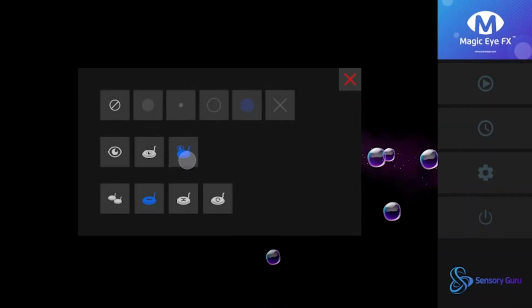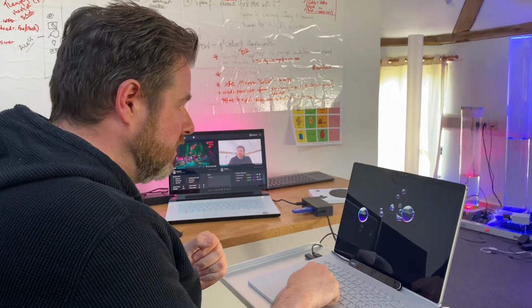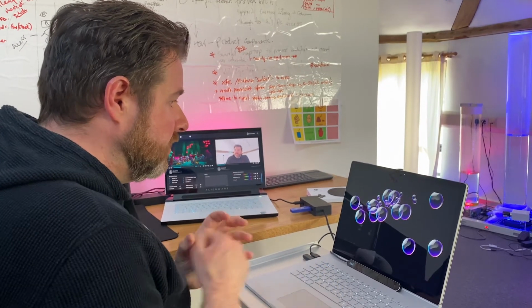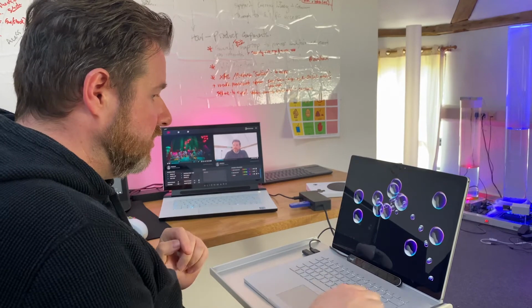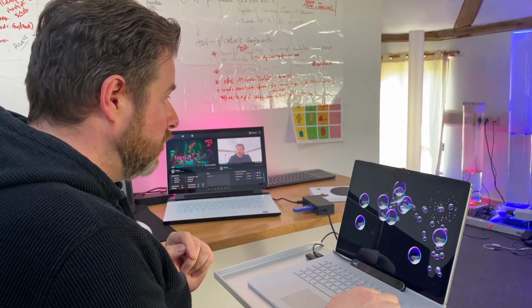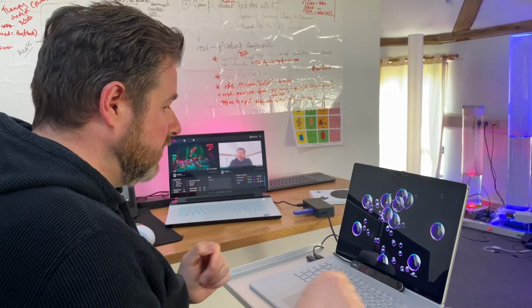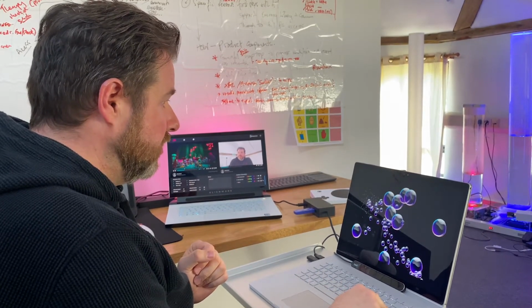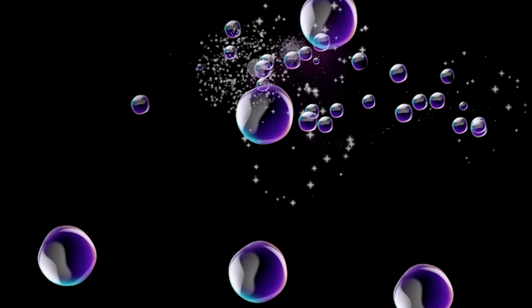I'm going to go over to the side here, and I'm going to open up our access menu, and I'm going to choose the eyes on switch option, okay, and then I'm going to close that. I'm still set up with a 0.1 second dwell time, but as I add in the objects, you'll see that they're not responsive, because what they now need is switch input. I've set this up to enter, so you can set this up with a head switch or however you like. But now I have to look at the objects to interact with them.